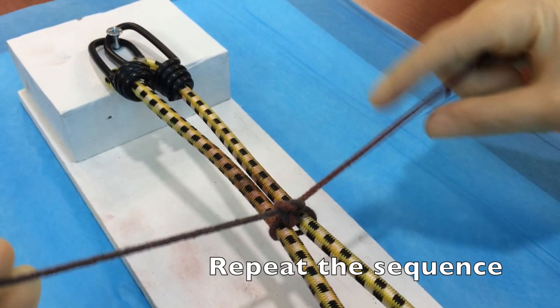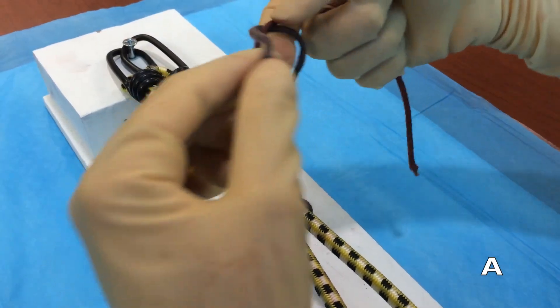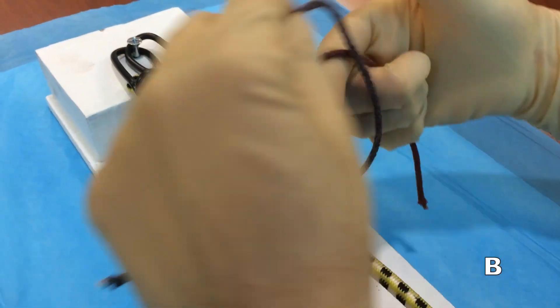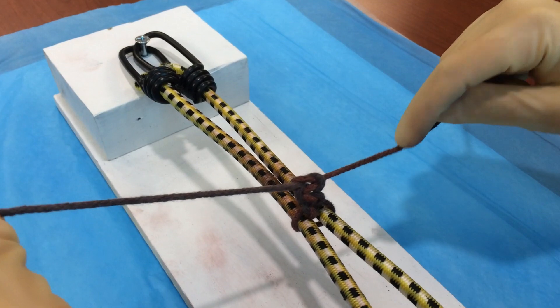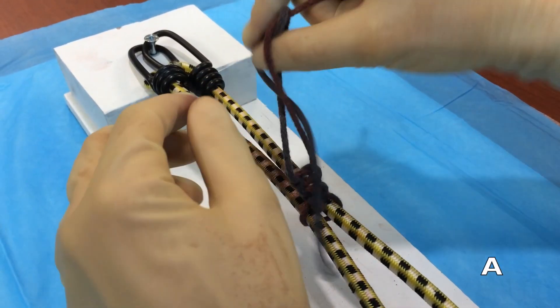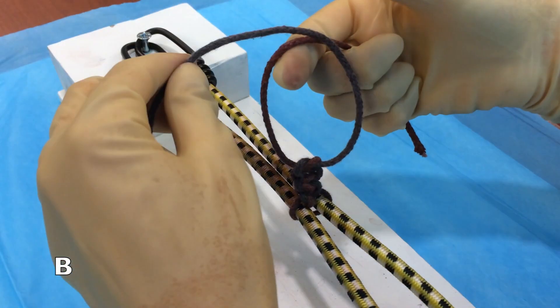To complete our tie, we're just going to repeat this sequence over and over again. Throw A — we're taking that strand and pushing it away from us through the loop and crossing our hands. Then throw B — we're grabbing the strand and pulling it back through the loop. Throw A, followed by throw B.